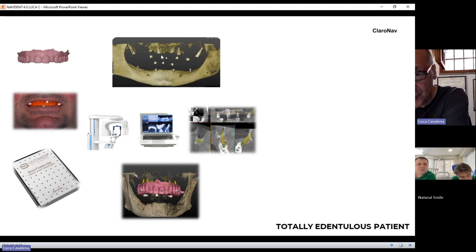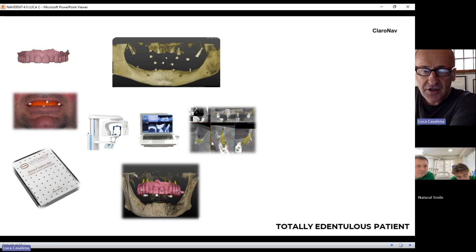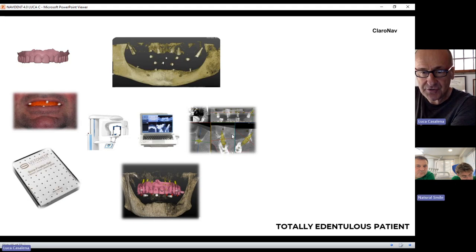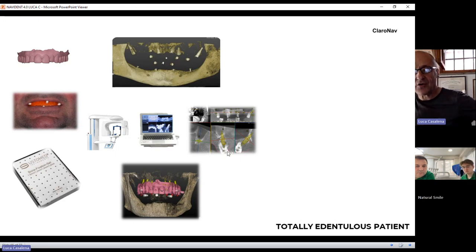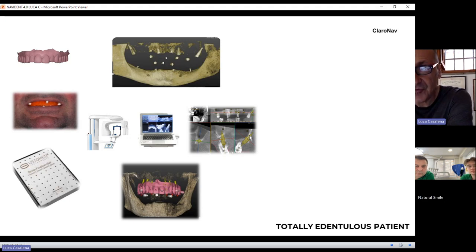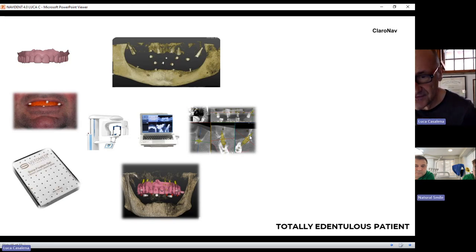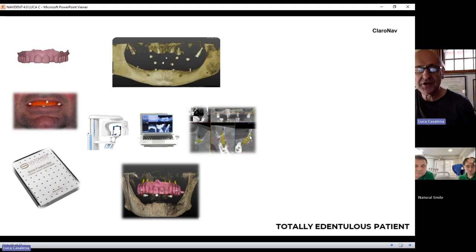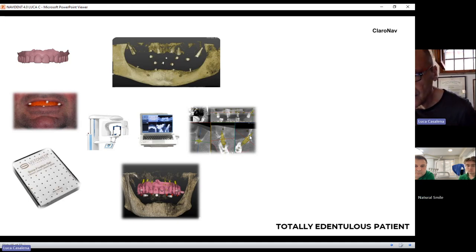This is essential for proper implant planning, because now you don't have only the bone volume — you also have the width of the soft tissue and the vertical length and volume of the tooth. You can place your implant according to the exact prosthesis you want to see on the patient's mouth. The planning doesn't take five minutes as with a partially edentulous patient — you may develop one, two, or three different treatment plans and eventually choose, along with the patient, the most suitable one.